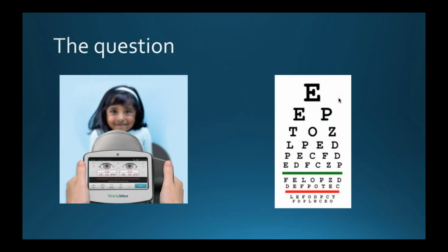So on the right is a visual acuity chart, where if they read on a certain line, then you can measure their vision as 20/20 or 20/30, 20/40, etc. Whereas a refractive error is a glasses prescription that would hopefully provide 20/20 vision for the child. So without glasses, they may be reading one of the larger numbers on the eye chart, or have a visual acuity that has a high second number, like 20/100.